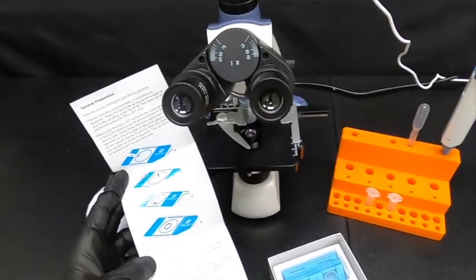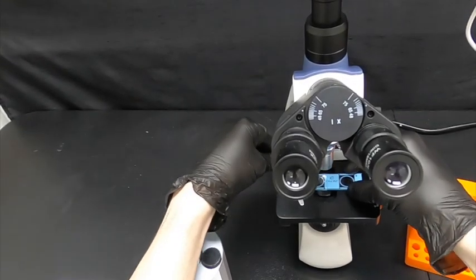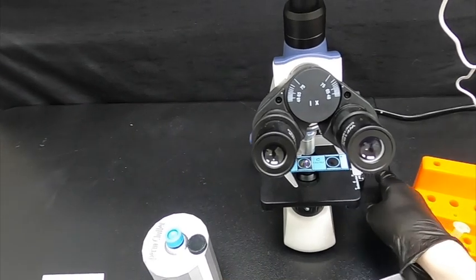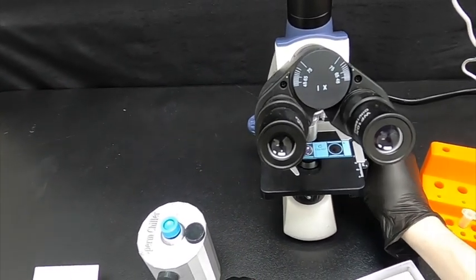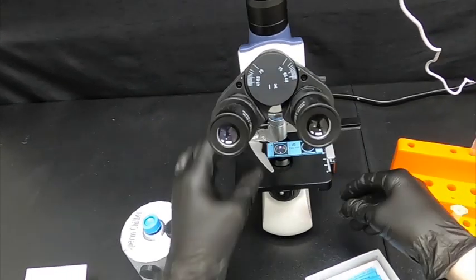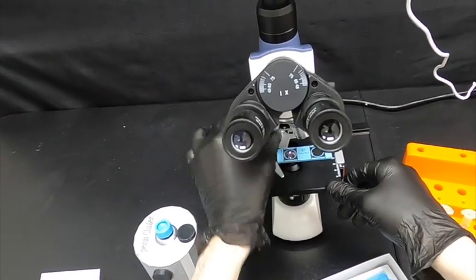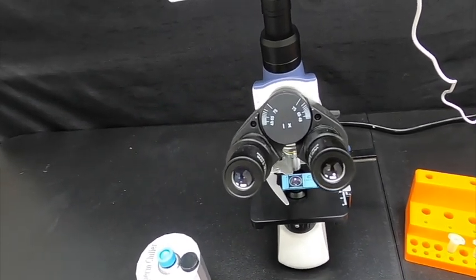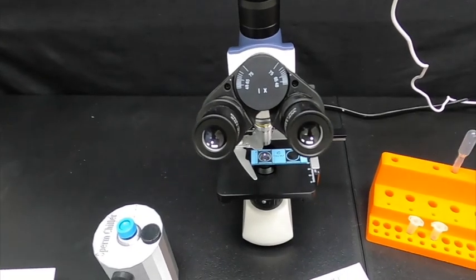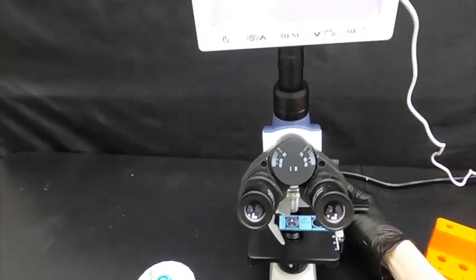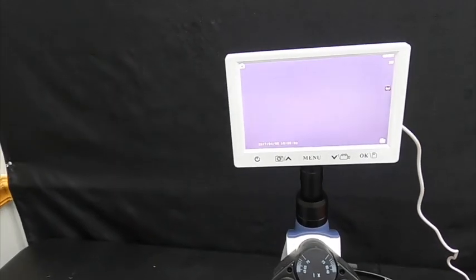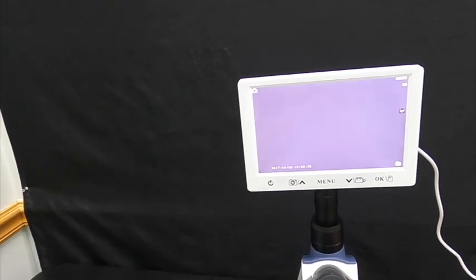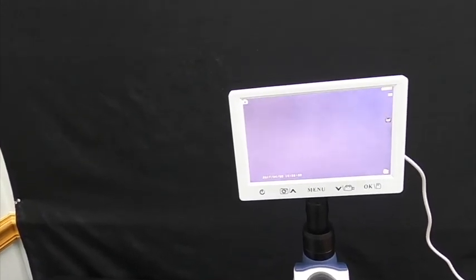Next, we're going to put the slide on the microscope and center it on test section A. We'll have to move it around until we find it, and then always start off with the lowest magnification on your microscope. That will enable you to catch when you're in focus quicker. With the coarse knob, we have nothing on screen—they're not in focus. We're just going to zoom in until we have them in sight.